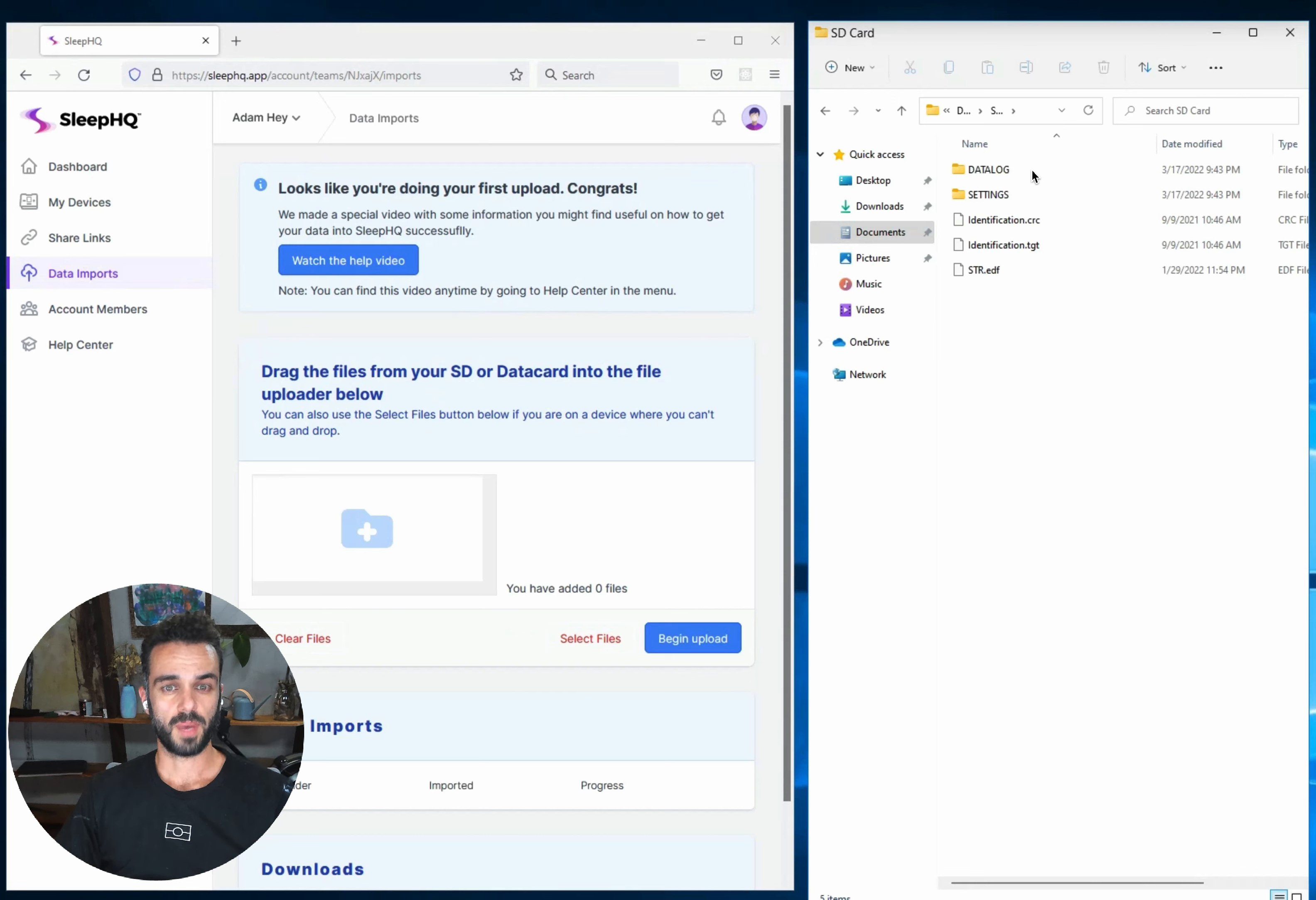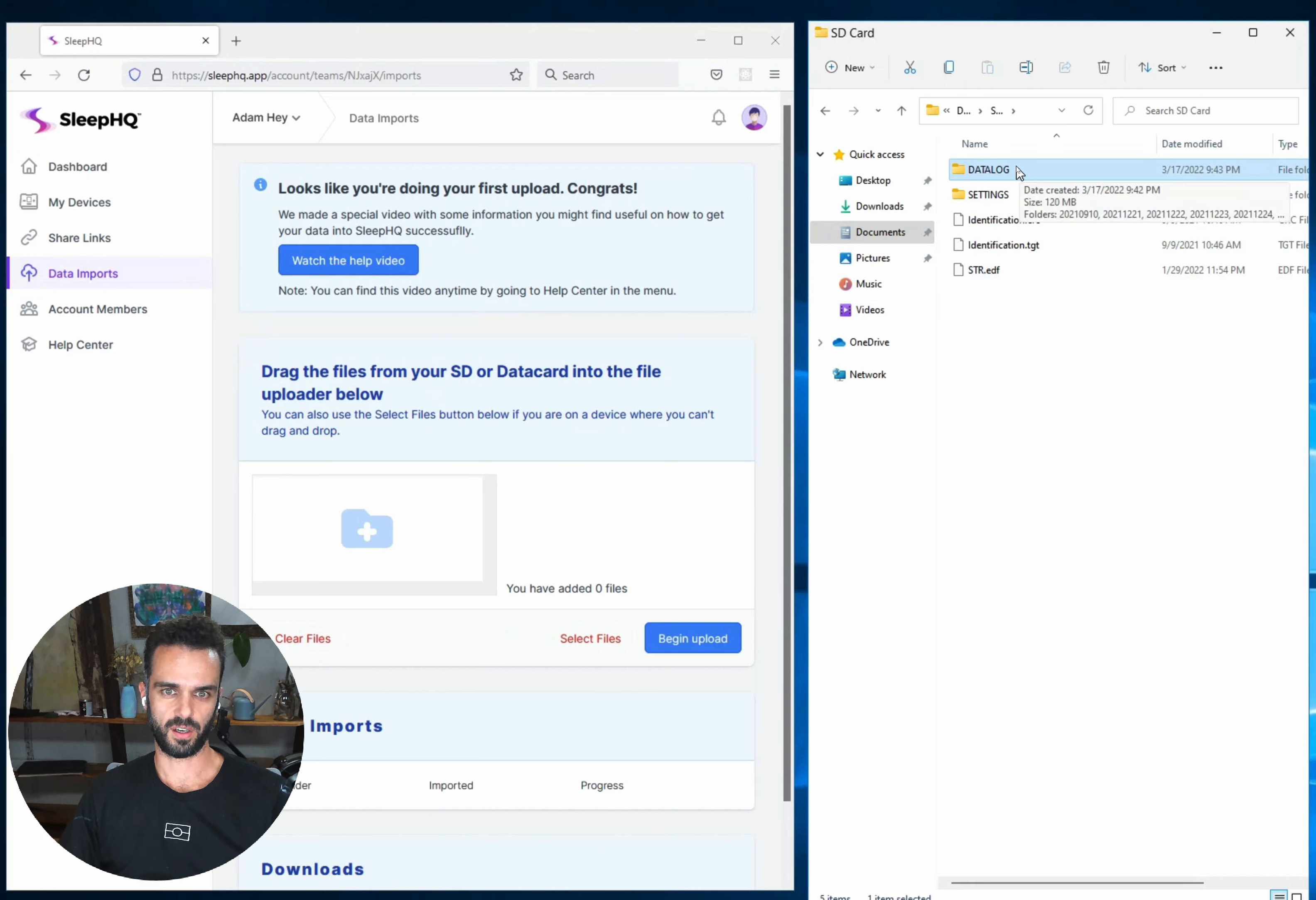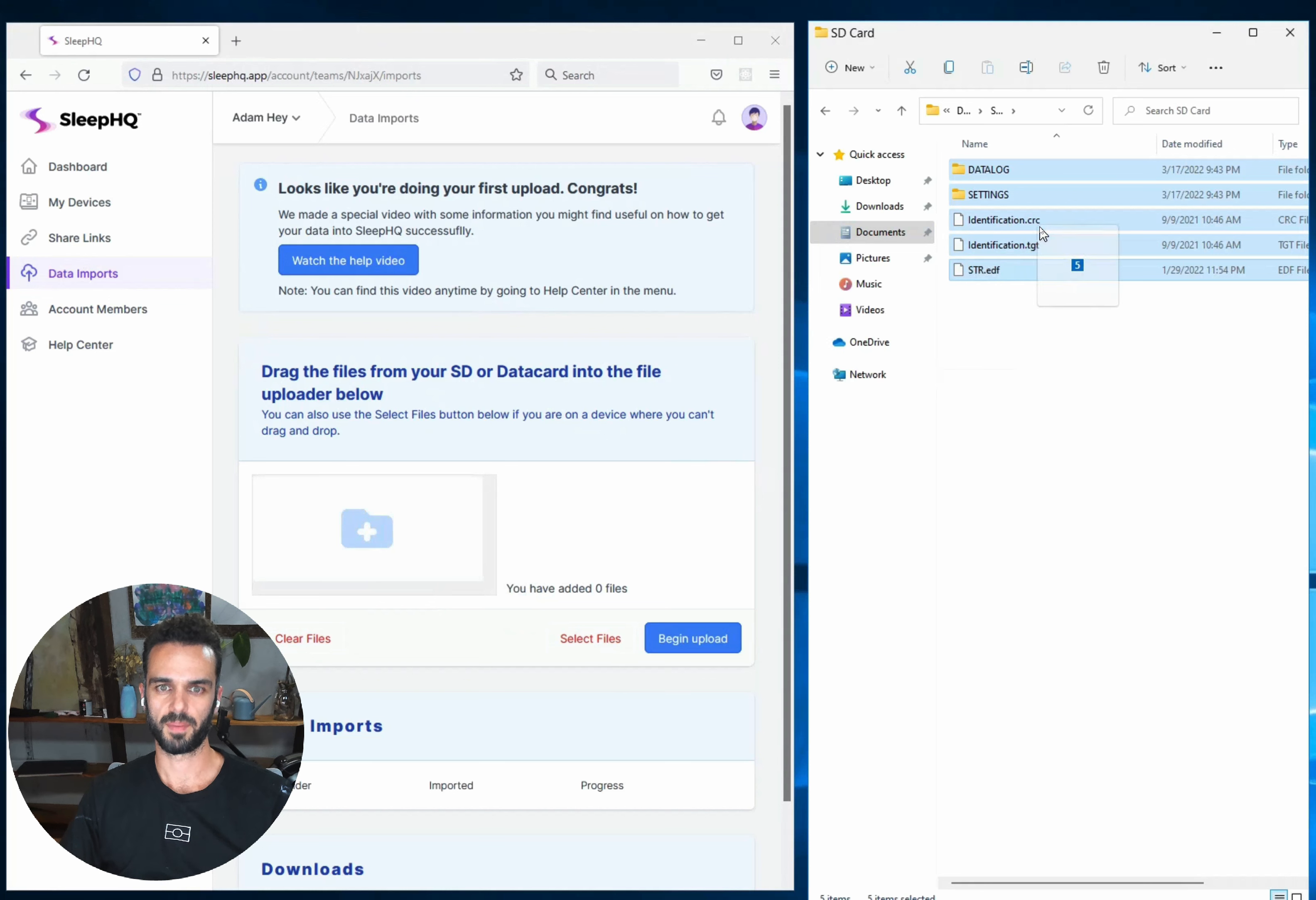Okay now for most people what you're going to want to do is just select all of the contents of your SD card and drag them straight in. So I can do that by clicking on the top folder, holding down shift, clicking on the bottom one and then just dragging everything straight across into this Sleep HQ upload window like that. And that's going to work for 90% of the people out there.